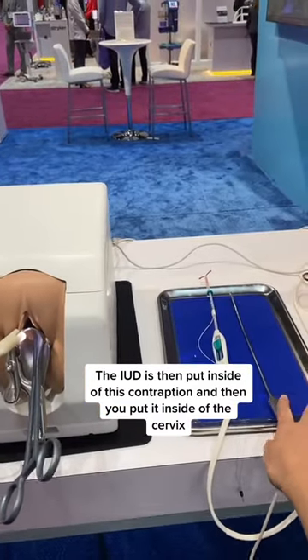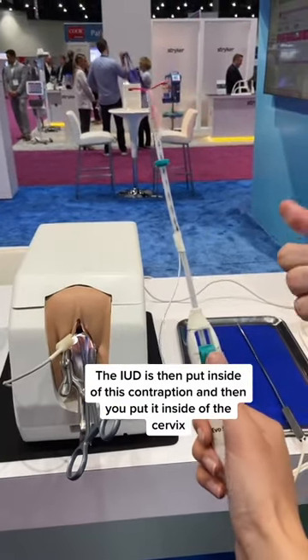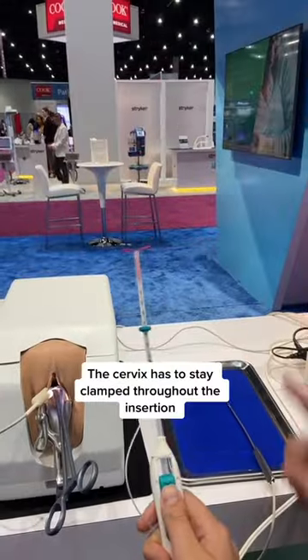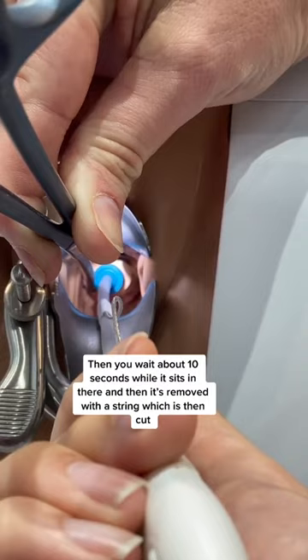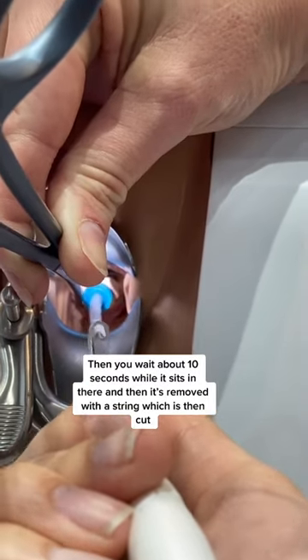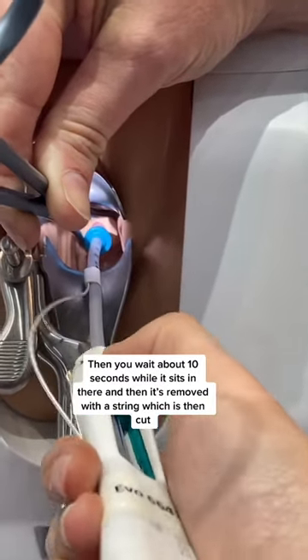The IUD is then put inside of this contraption and then you put it inside of the cervix. The cervix has to stay clamped throughout the insertion. Then you wait about seconds while it sits in there and then it's removed with a string, which is then cut.